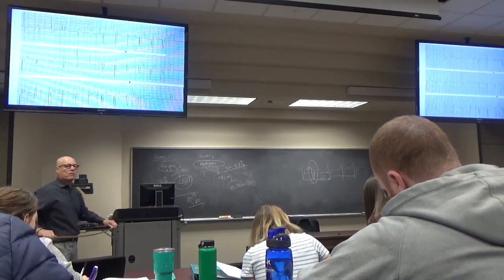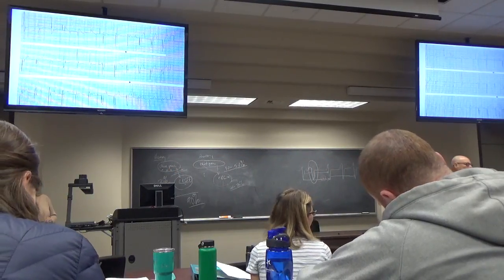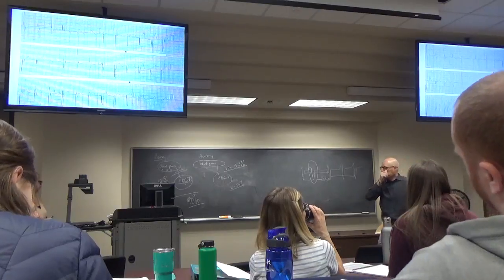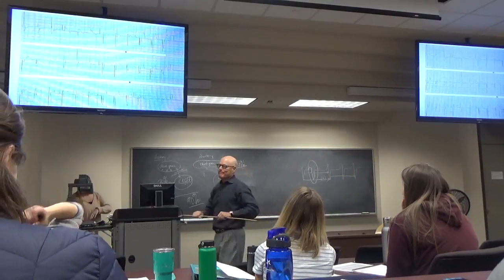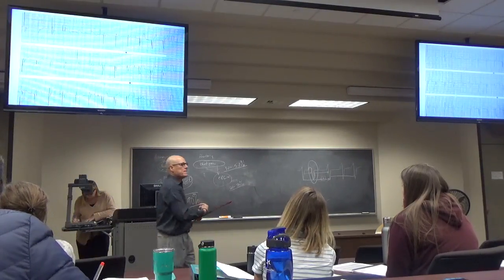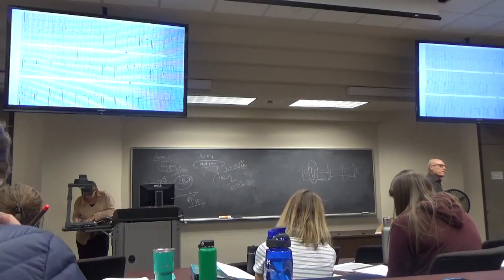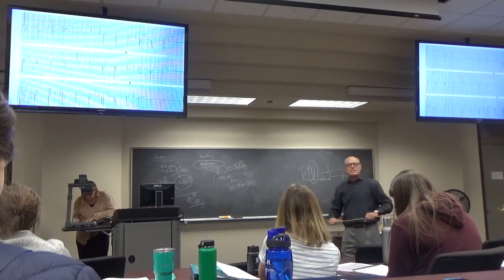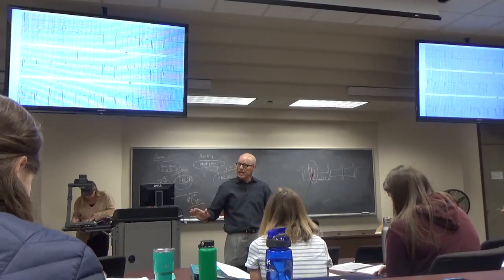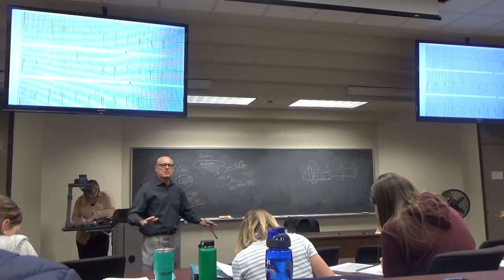I initially thought you could tell, using the same logic as you use for bundle branch blocks, but as it turns out, what they do is they put this pacemaker most commonly on the epicardium of the heart. So this is a lead that's placed somewhere on the outside of the heart. You can't tell usually whether it's sitting on the right ventricle or the left ventricle. So this is a ventricular pacemaker. That's all you can tell. The intervals don't matter. You can't read ischemia. It's just a pacemaker.